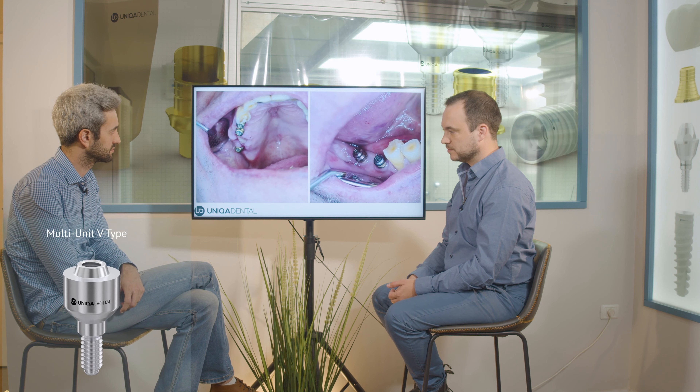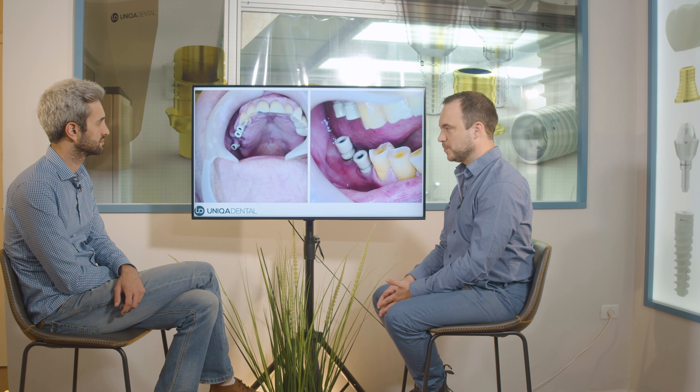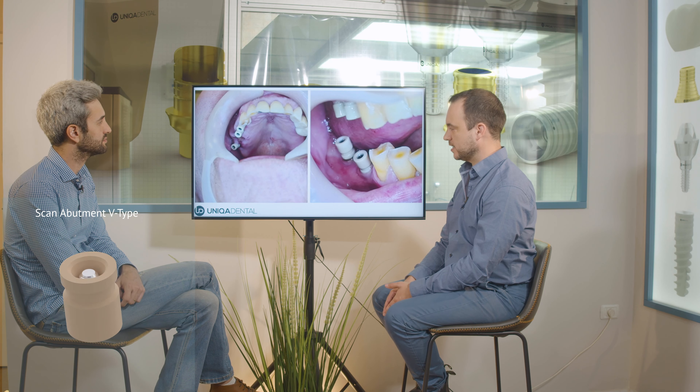Later on we took impressions with scan abutments and an intraoral scanner. You can see here that on the upper jaw we have three implants with three multi-unit V-type on top of them and three scan abutments. Impressions were taken with the intraoral scanner. On the lower jaw we have two implants with two scan abutments.